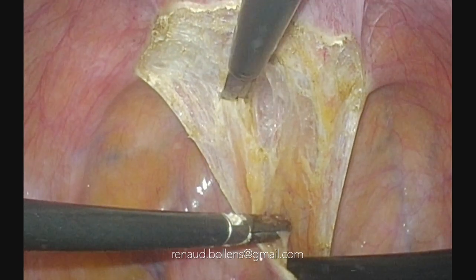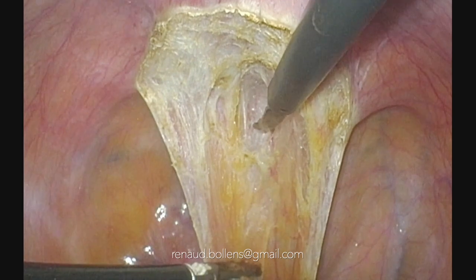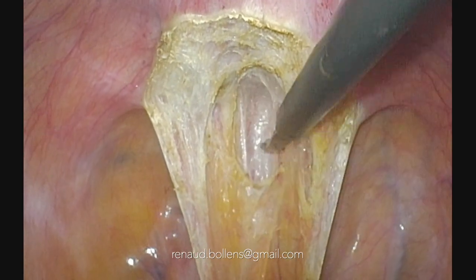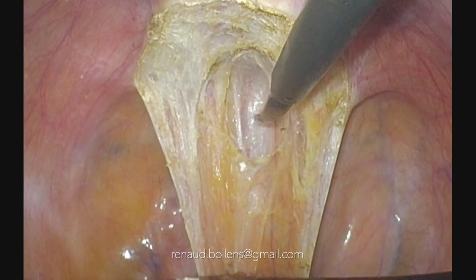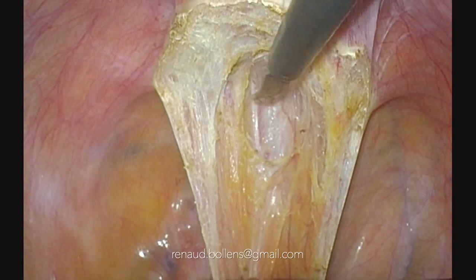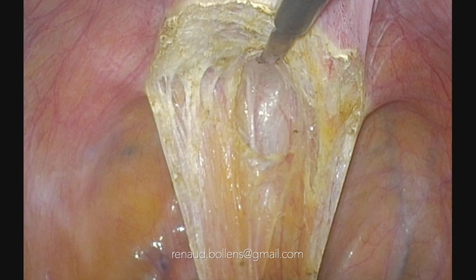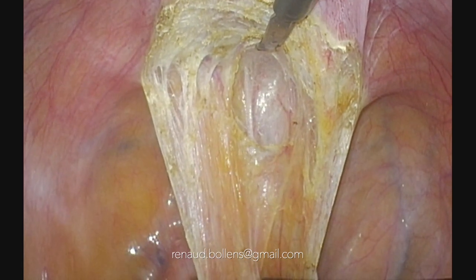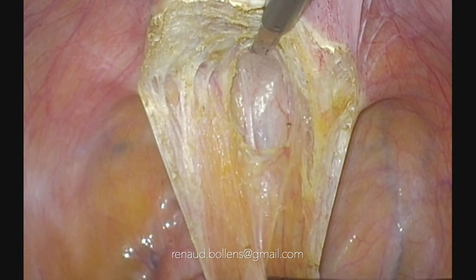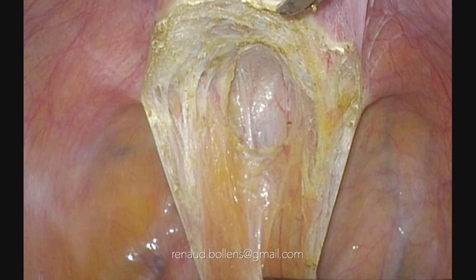The mistake of the beginner is to not push in the good direction. When you are at this level, everybody has a tendency to push down here, and they hope that the plane will be open. In fact, the movement that we must do is an elliptic movement. An ellipse is defined with two centers, and the two centers of the ellipse must be parallel to the plane that you want to dissect. The plane that we want to dissect is not the rectal plane, it's the vaginal plane. Then it's not this movement that we must do, it's this movement.